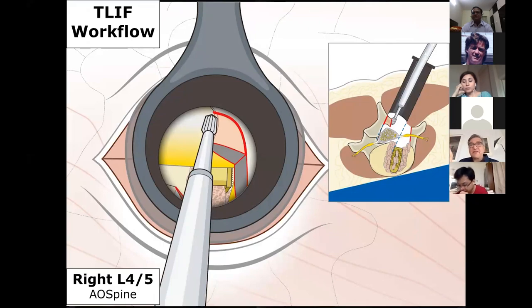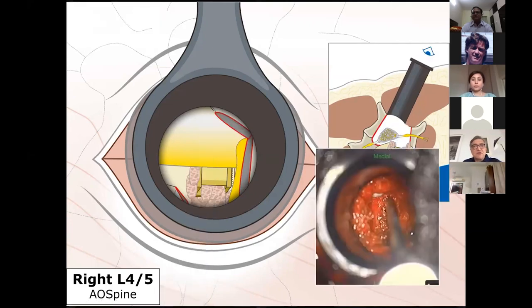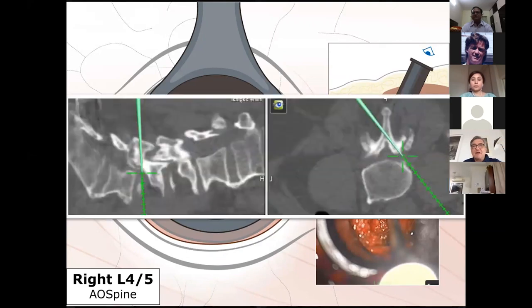Now, a lot of patients will require decompression. Some patients may have severe lumbar spinal stenosis. So in those patients, you want to do a decompression of the spinal canal, the thecal sac, and that's when the over-the-top decompression comes in. So now we're rotating the table away and we're angling the tubular retractor to get access to the inferior portion of the spinous process and then eventually to the contralateral lamina. We leave the ligamentum flavum sometimes intact, or we protect the dura with a suction tip, and then we drill and decompress the spinal canal. So that's essentially what we do here. We get a bilateral decompression from a unilateral approach, and we call that over-the-top decompression.